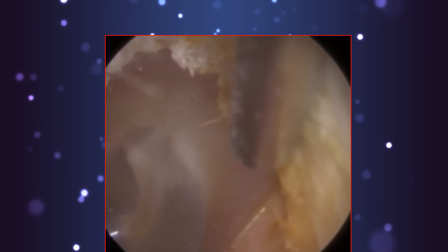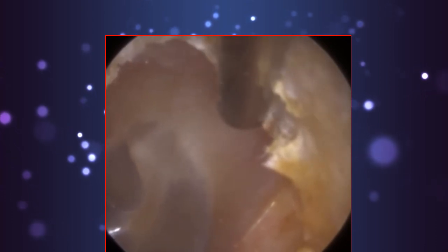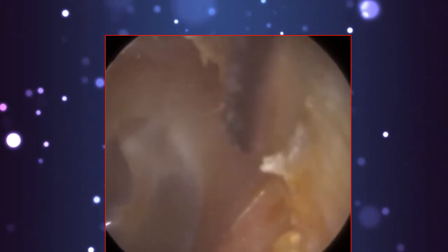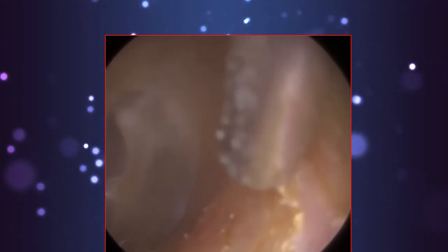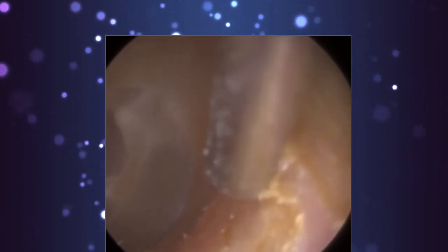They give it a cotton wool, and you attach it to the end of a Jobson horn or St. Bart's ear hook. There's a serrated tip there, and you wrap the cotton wool around the serrated tip, then go into the ear and spin it. I don't like doing that because I think you're grazing the ear canal deeper in the ear as well, making it more susceptible to infection in some ways. And you can always get these fibres that come loose in the ear. But they're doing that also with the majority of their patients.